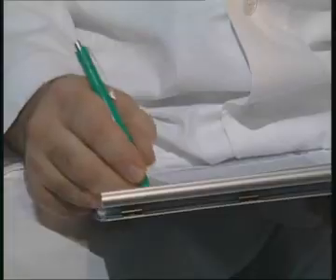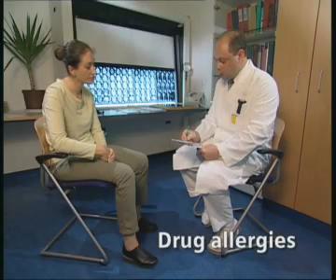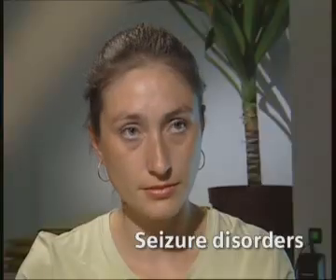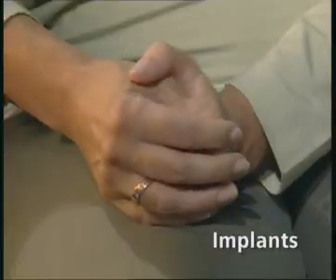A detailed questionnaire is essential. This includes the comprehensive medical history of each patient. Here are some of the most important questions. Does the patient have any allergies that could react to the contrast medium? Is the patient susceptible to seizures, for example, epilepsy? Did the patient undergo an operation? Does the patient have any passive or active implants, for example, clips or a pacemaker in his or her body?